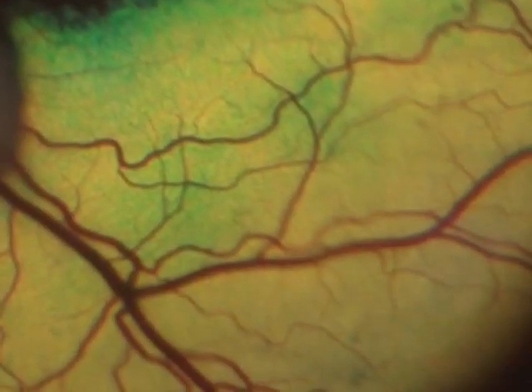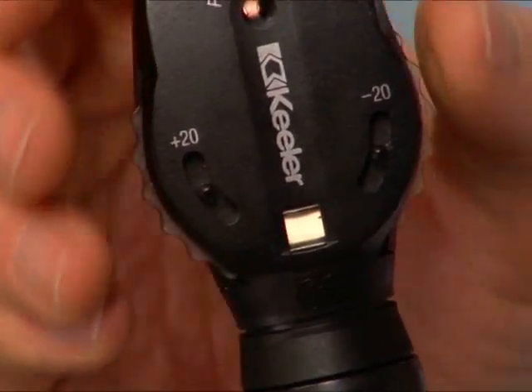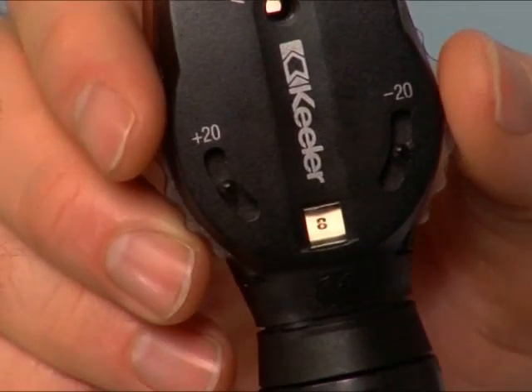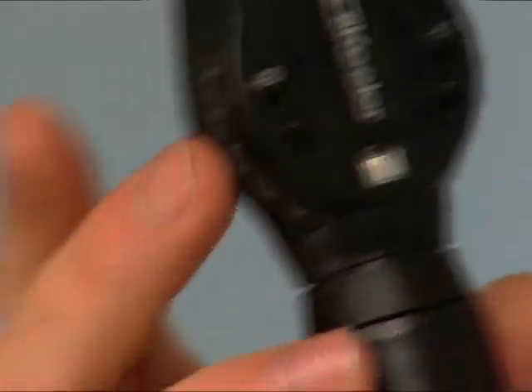Once you've performed a fundus exam from a close direct ophthalmoscopy position, you can utilise the different lenses, the lens carousel once again, to change your point of focus in the eye. So as you go more positive, you will bring that point of focus more anterior in the eye. So generally about +6 or 8 will start bringing the lens into focus. +10 will bring the front of the lens or the iris into focus, and then potentially even the corneal surface about +12, +15.